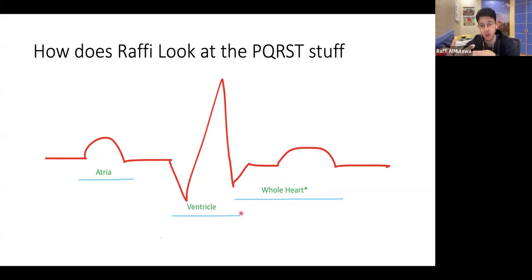For example, sometimes we have a disease called atrial tachycardia. What happens is that there's an abnormal focus in the atria. As a result, the P wave is abnormal. So the P wave, you see, it's nice and upright. I know this is a drawing, but it's nice and upright. Let's say in atrial tachycardia, it goes upside down. There you go. You know the problem is in the atria. There's an ectopic atrial focus.